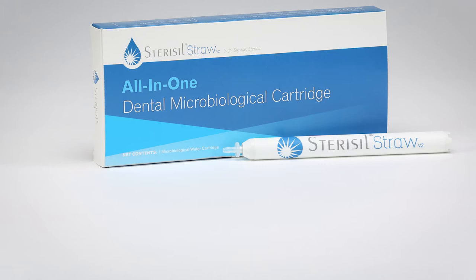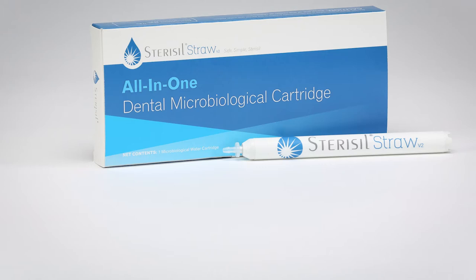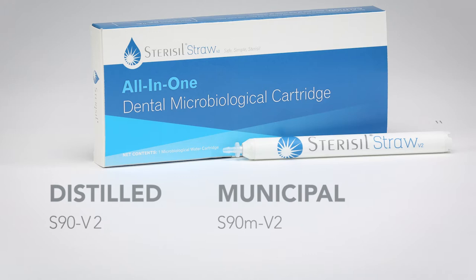Here are some things you need to know before you start using the Sterosyl Straw. The Sterosyl Straw is available in two versions: distilled and municipal. Part numbers are listed on the side of the box. The S90 V2 and the S90M V2 are designed to service your dental water lines for 90 days.